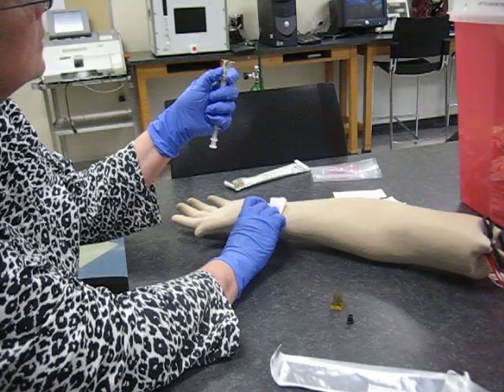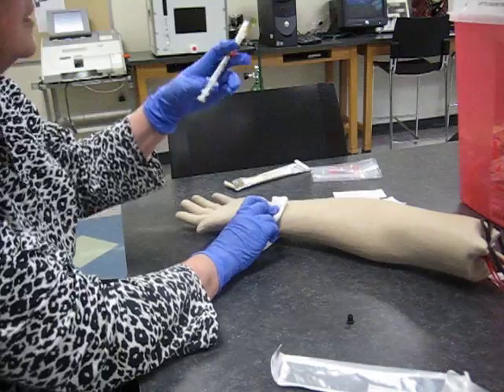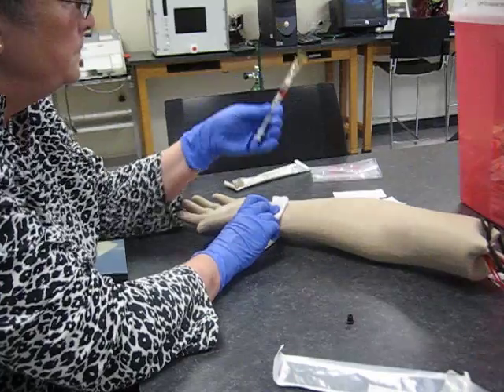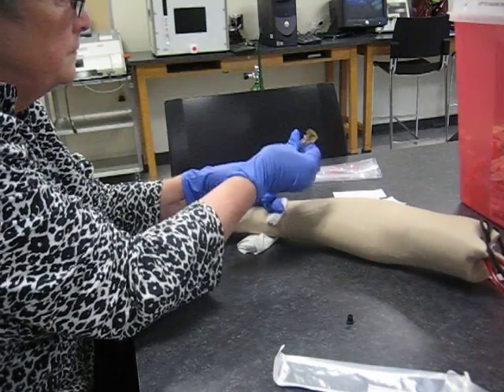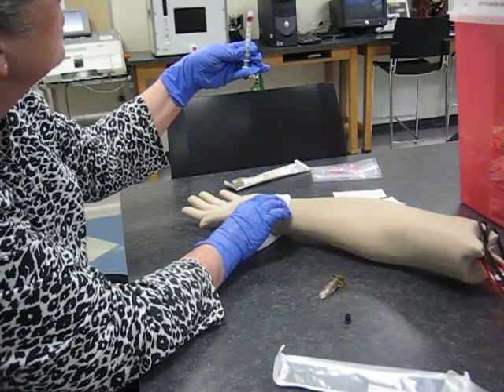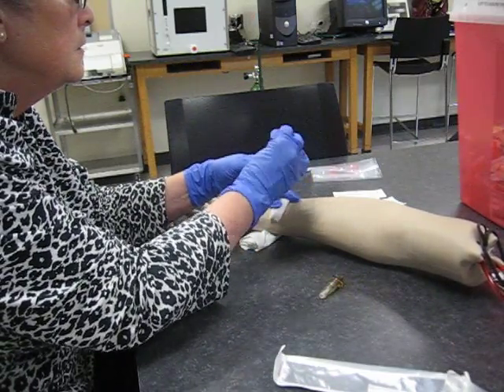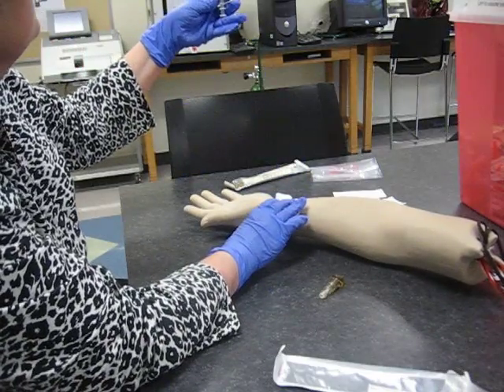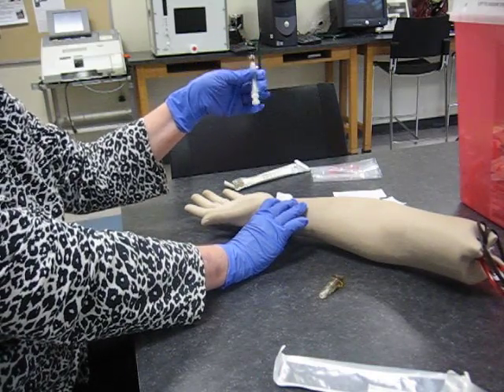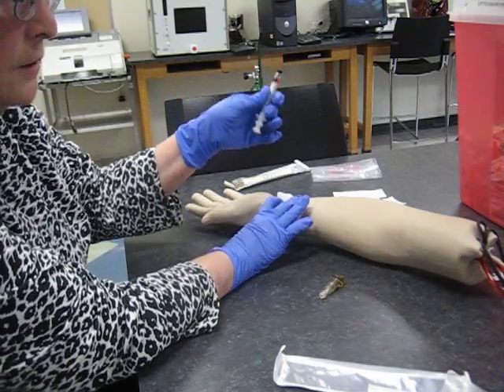First thing you want to do is protect yourself from the needle. Notice I'm keeping pressure on here — if you're with me, I will hold pressure for you. Mr. Hand, you're doing fine. Now I've got rid of my air. I roll it gently back and forth — do not do it vigorously, I do not want to rupture the cells. If we have to get an electrolyte, this will throw the potassium way off.